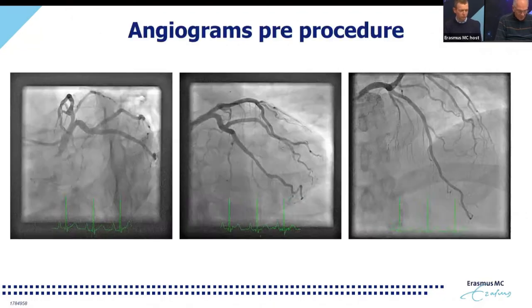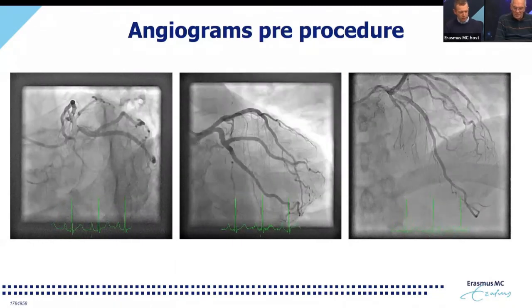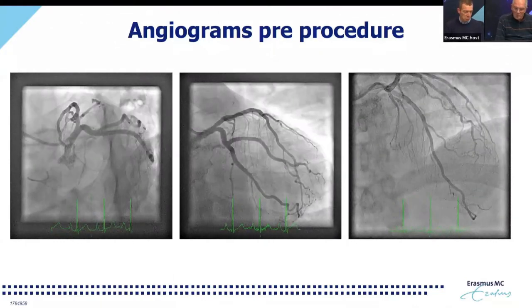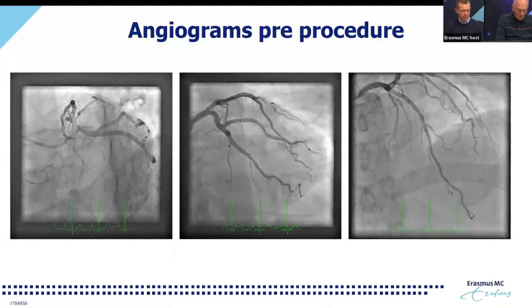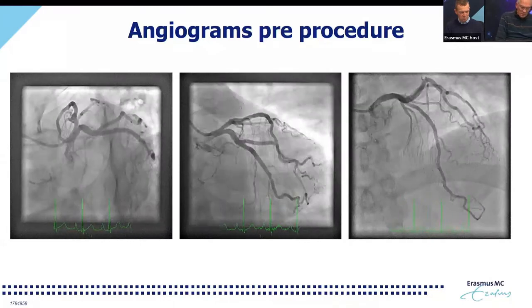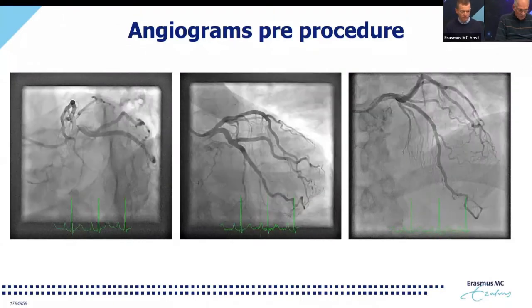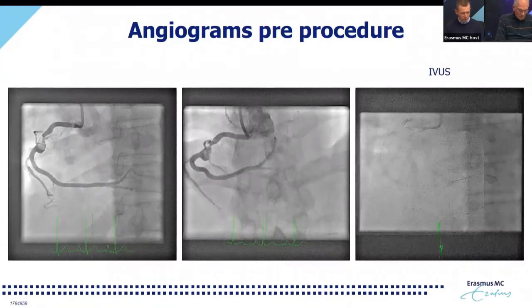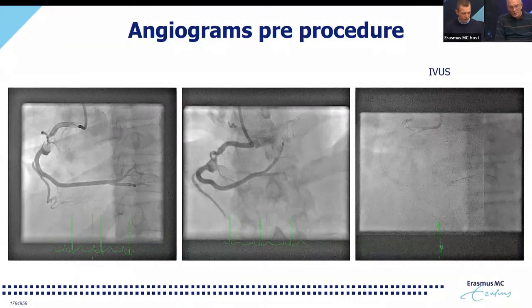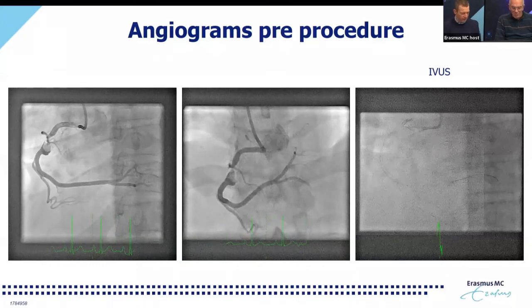And this patient was brought to our cath lab actually very recently, in which we started with a right radial approach. This was a Judkins 3.5 in the left system, showing you an actually normal, I would say, left coronary system. Right dominant system, but this left system, mild luminal irregularities, but no apparent or relevant disease. So different it was on the right side. This was the right coronary artery, showing you two things: one, an enormous aneurysm, and something that looked like a thrombus.